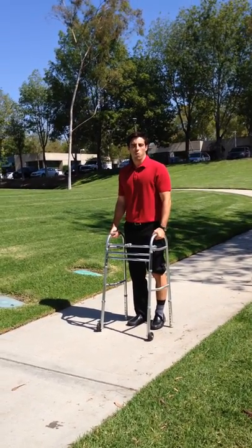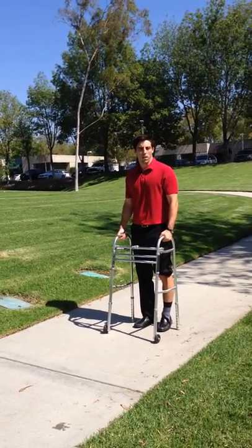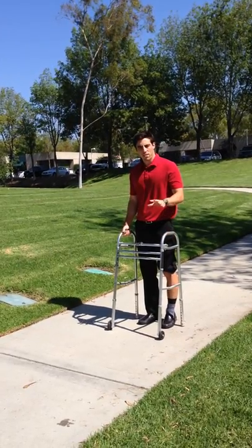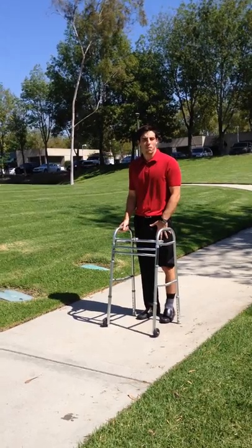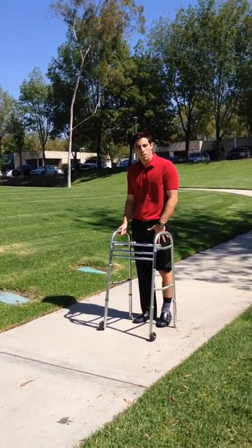Now I'm going to teach you how to walk with a walker when you are non-weight bearing on one limb. For the instance of this video, my left leg is a surgically repaired or injured leg that my doctor has told me to not put any weight on.